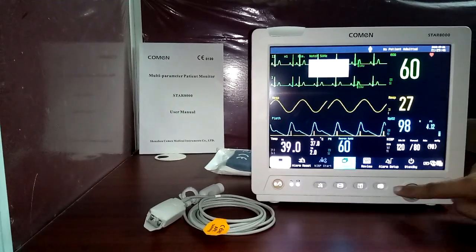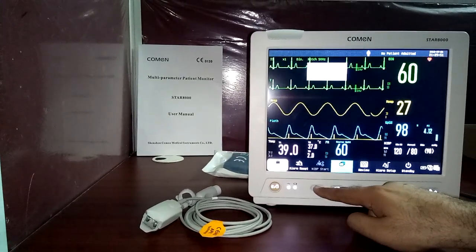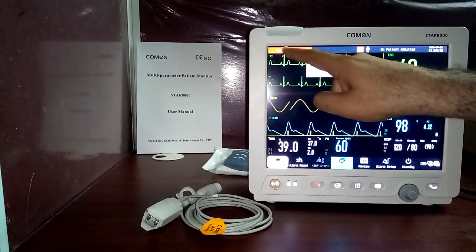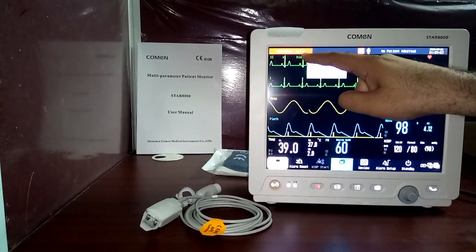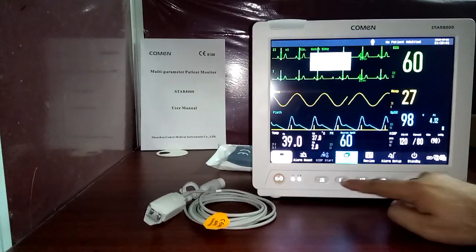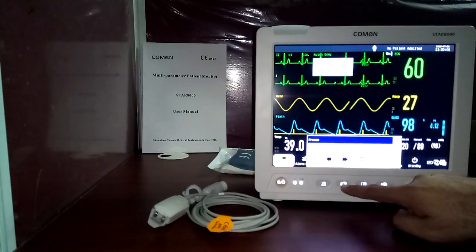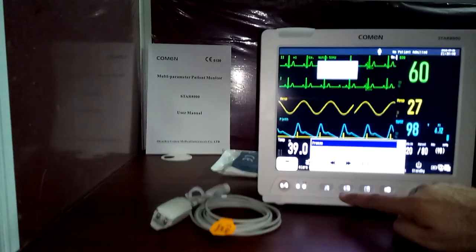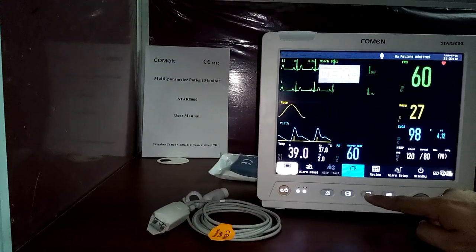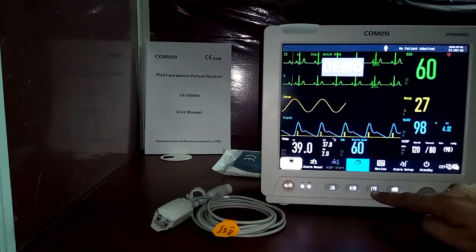There are shortcut keys on the front of the monitor. This button is for alarm reset — if any alarm is active, you can pause the alarms for 120 seconds. This is the screen freeze button; you can freeze the screen to view details. This button is for the optional printer — press it to get a printout.